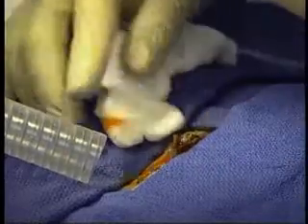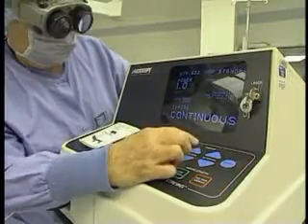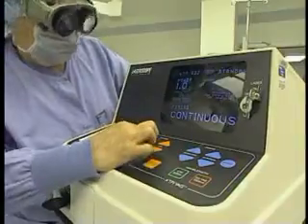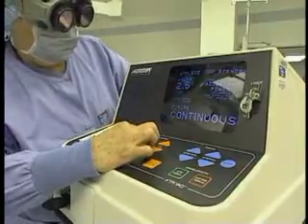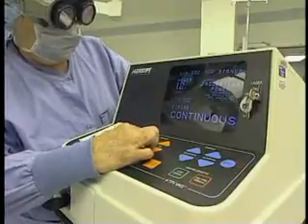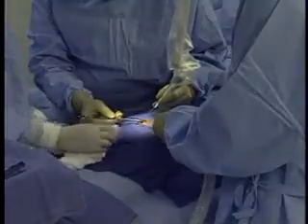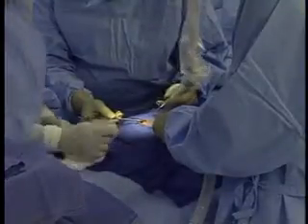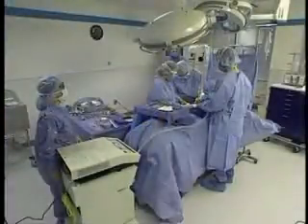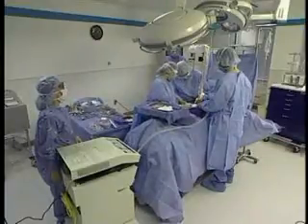AORN's recommended practices for laser safety in the practice setting advocate controlled access to areas of laser use and identification of nominal hazard zones. The safest practice related to the measurement of nominal hazard zones might be to consider the room in which the laser application is occurring to be the zone of hazard for everyone. Laser energy is usually contained within a room unless open doors or transparent windows exist, and the wavelength being used is capable of traveling through these openings.